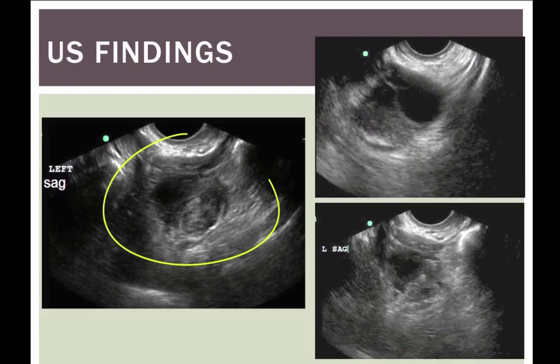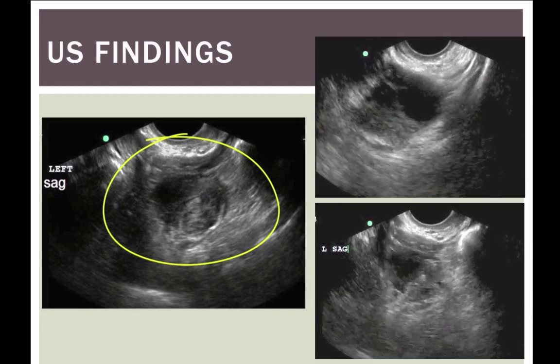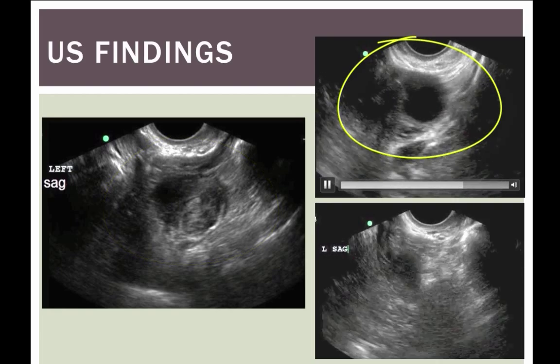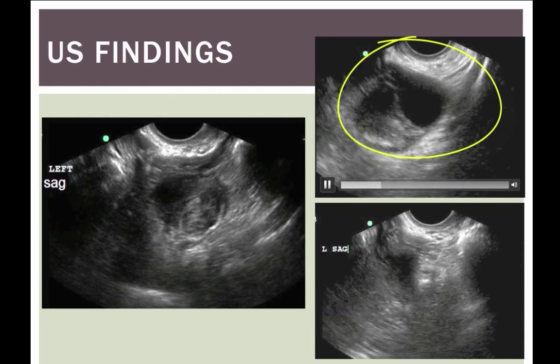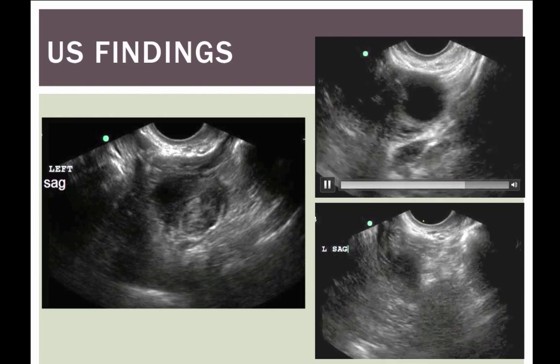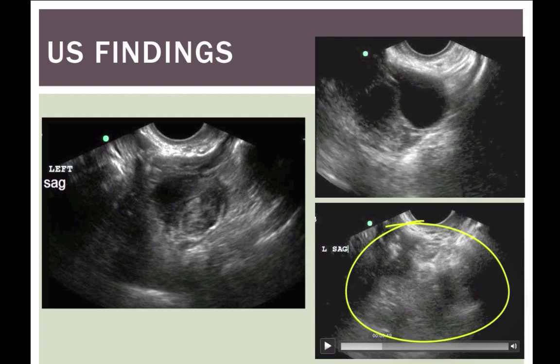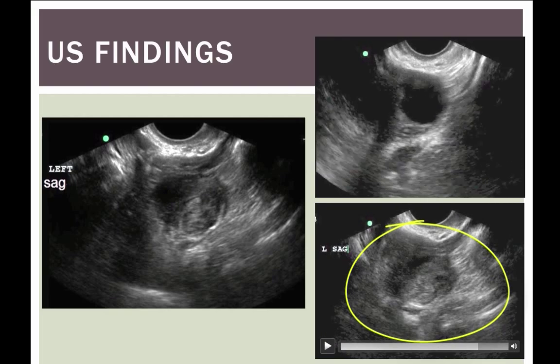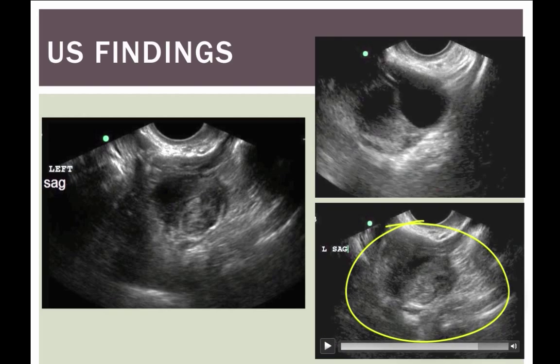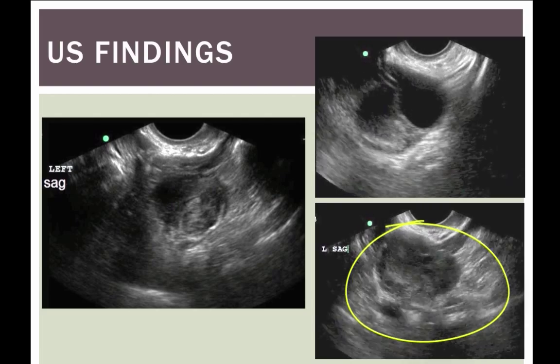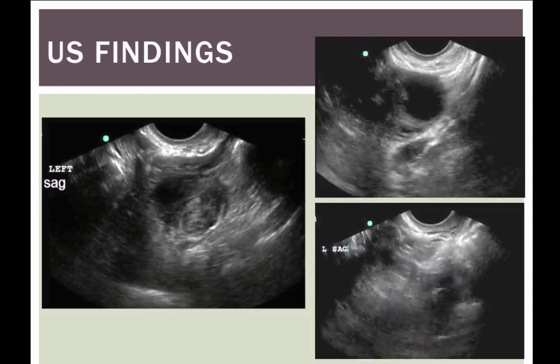Then we get views of the adnexa. This is over on the left, and what we see here is a complex mass with increased echogenicity. This is part of the adnexa, looks like the left as well. There's a simple cyst and some increased echogenicity here. And this is just another sweep through that thing - it looks like we've got an increased echogenic mass in the left adnexa and some cystic material as well. This is all concerning for ectopic pregnancy.